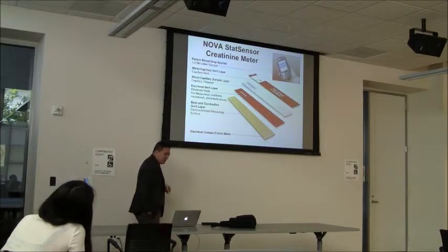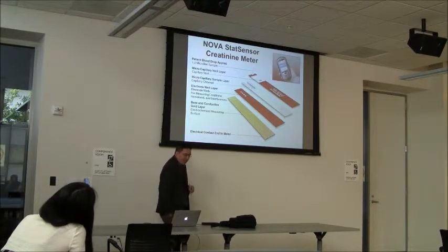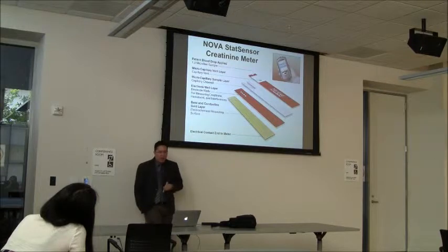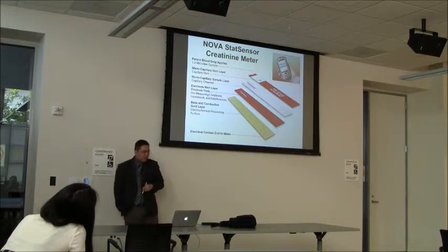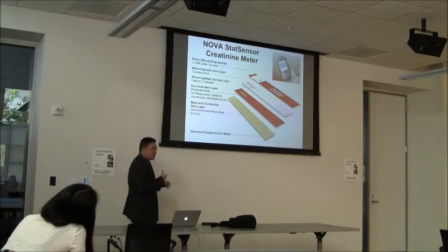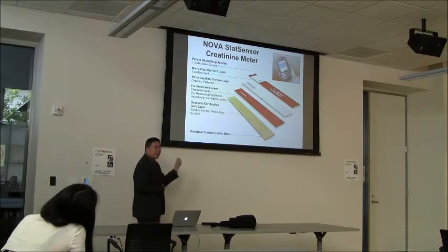Here's some sensors here. So point of care testing at its finest. So this is a point of care creatinine meter. The same platform can test other types of analytes. What I want to highlight with this sensor is it's a gold electrode. Gold, okay, great, it's not that fantastic, but it's one of the first to adopt the gold electrode to increase the conductivity to allow it to have accurate low volume testing. So 1.2 microliters of whole blood is all that's needed.